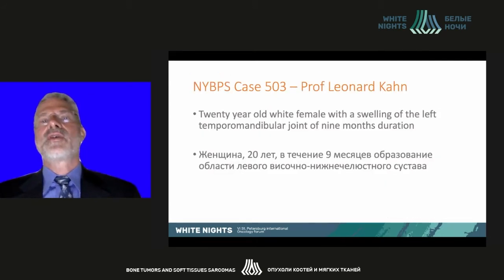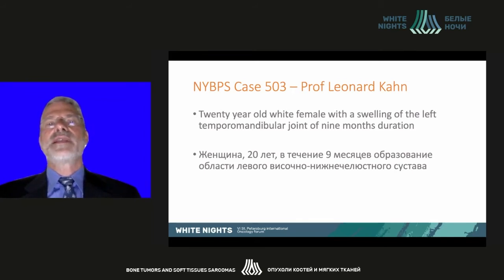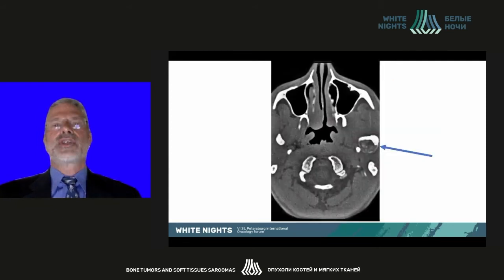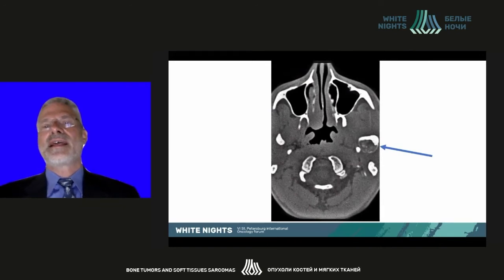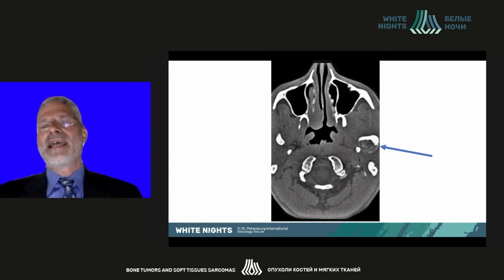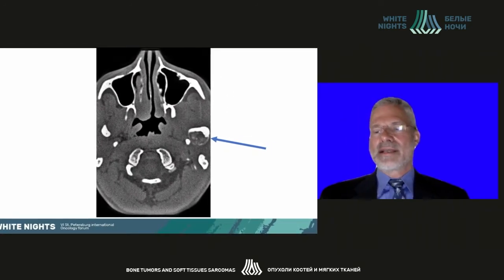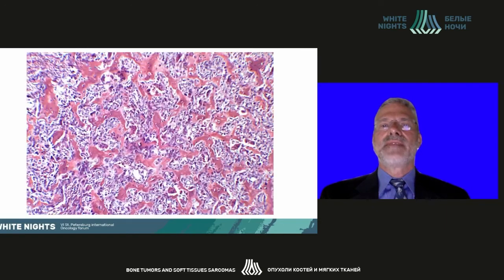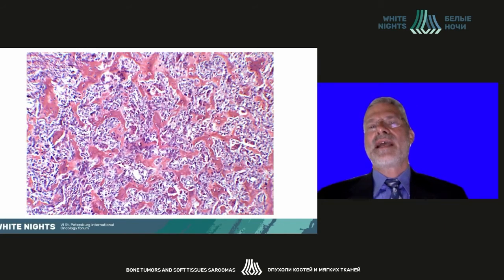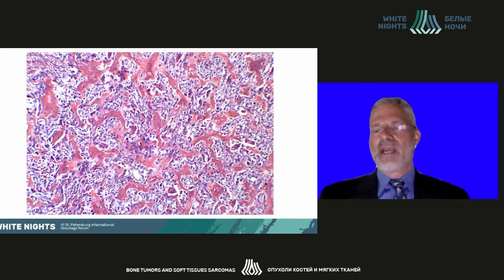The first case is courtesy of Professor Leonard Kahn. It's a 20-year-old white female with swelling of the left temporomandibular joint of nine months duration. On the left, there is a lesion destroying the neck of the mandible, with an expansile lesion that has radio-dense bony elements within it, high attenuation seen on CT. On pathology, we see classic mature bone formation with extensive osteoblast formation without any evidence of malignancy. This is classic pathology for an osteoblastoma.